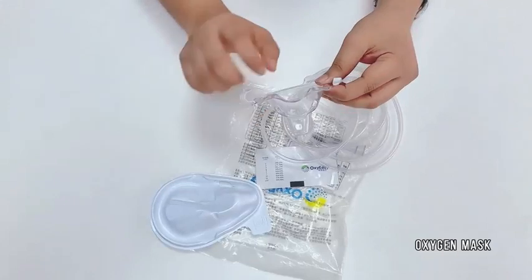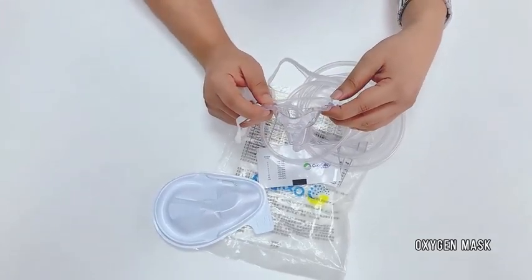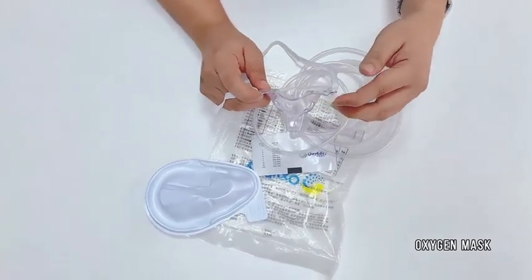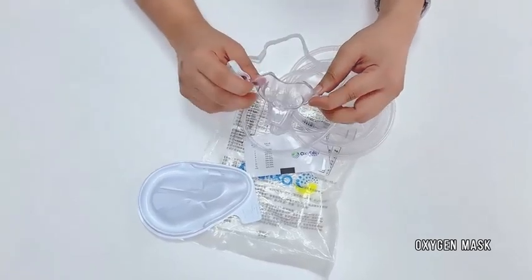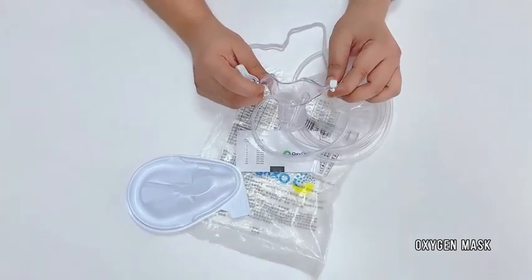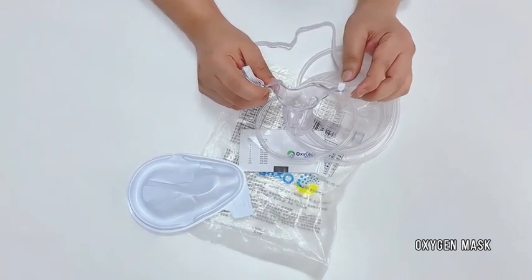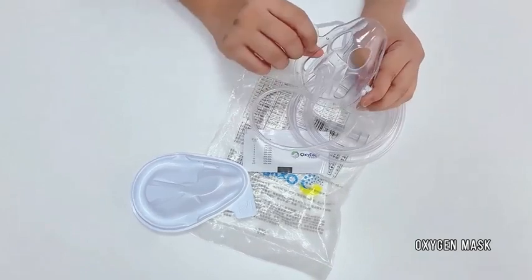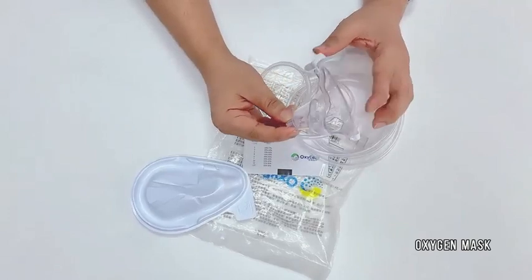You can see there are some holes here so the carbon dioxide can easily pass away from this mask. The patient will feel more comfortable if the carbon dioxide goes away. It is a bit more comfortable and easy compared to a regular or normal mask.